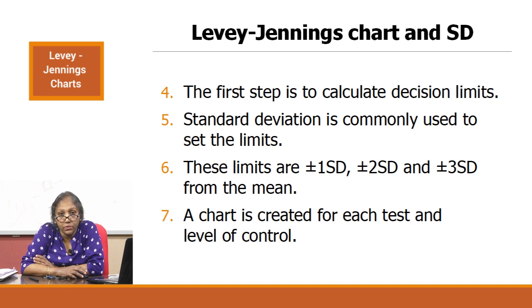But the Westgard rules that we are going to talk about in the subsequent videos may not become immediately applicable to that. So a lot of laboratories, despite having a built-in QC module in their equipment, may still want to do it outside on an Excel sheet so that you can define the 3 SD limits. Because what is the problem in limiting yourself to 2 SD? The problem is that you have valid runs, 5% of the runs. If you remember the 68, 95, 99 rule, you have 5% of your normal runs going beyond 2 SD. So you may be rejecting runs unnecessarily.